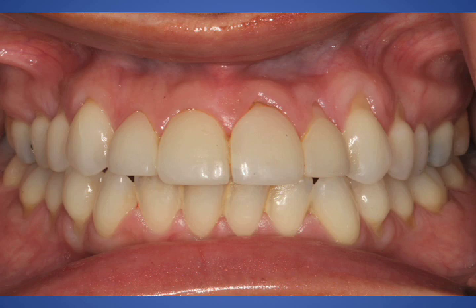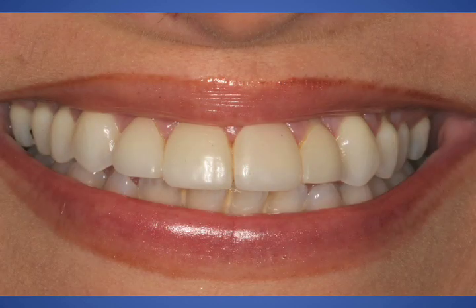Today's patient had a unique situation. She had periodontally involved maxillary anterior teeth. She had significant bone loss around these teeth and mobility. Her main concern was that she would not be able to function for any length of time. She knew she was going to lose those teeth. But a bigger concern was aesthetics, meaning she would come into the office, the dentist would have to remove her teeth, and she would leave the office either with nothing, which was not acceptable, or something removable, which was equally distasteful to her.